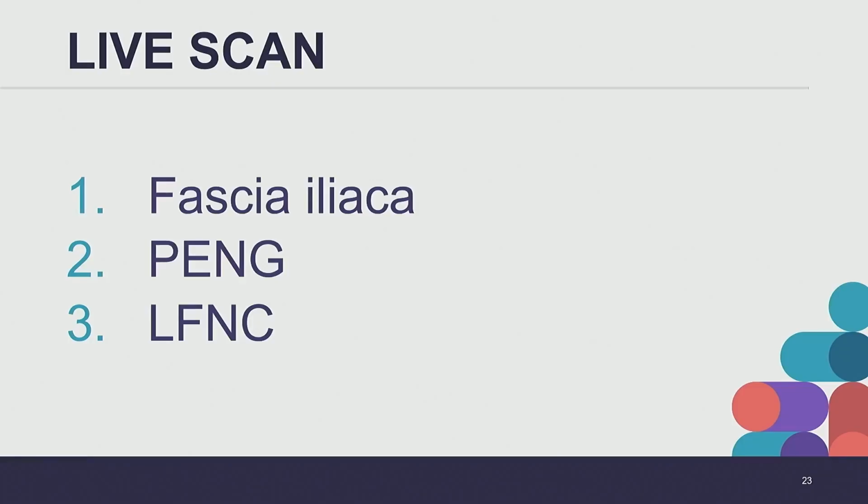Okay. So like you said, we're going to feel for ASIS. ASIS was that hyperechoic little dome that you saw right there. And then I'm going to slide just medial to that until you see this bone down here. That's the anterior inferior iliac spine, the IIS.